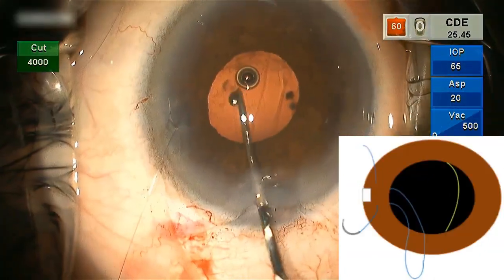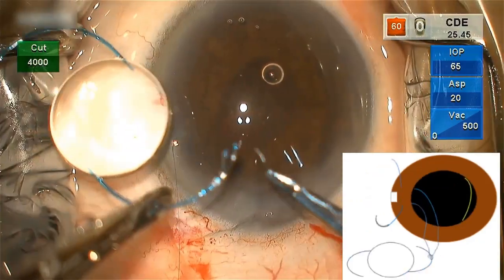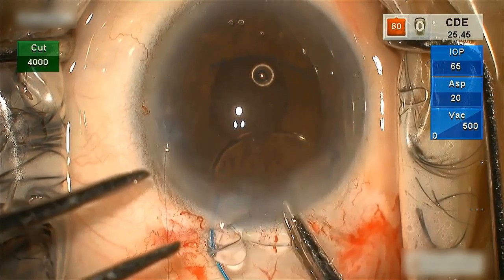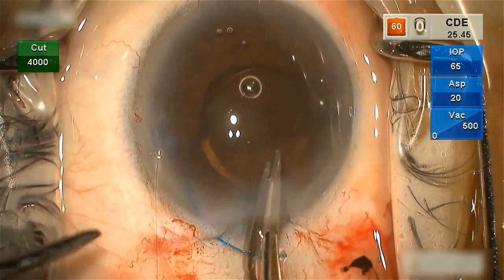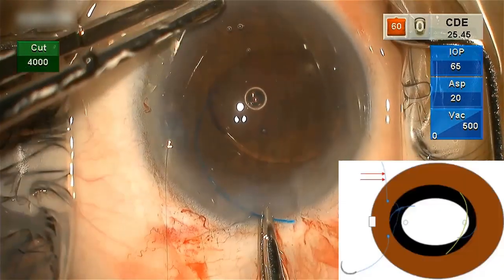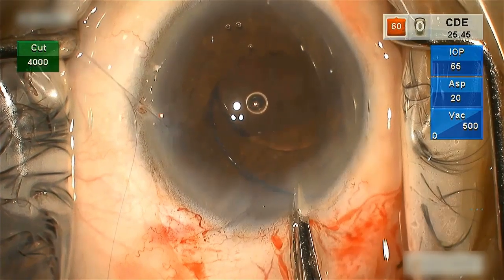A Kuglen hook is introduced through the tunnel to externalize the suture loop from below the iris. The suture loop is twirled around the haptic of the three-piece intraocular lens. The haptics are gently flexed and placed in the sulcus area. The intraocular lens should not be dialed in this case, because dialing of the IOL can cause slippage of the sutures. The suture ends are gently pulled so that the suture around the haptic is taut and does not slip away from it.